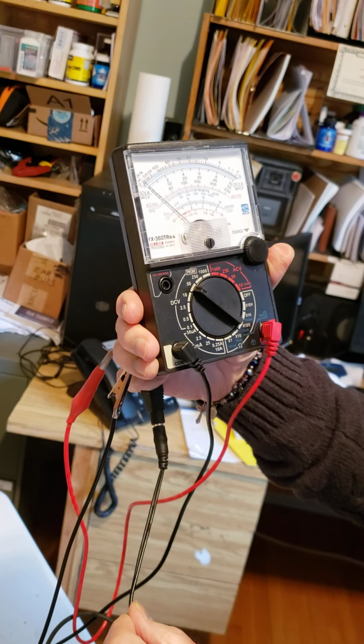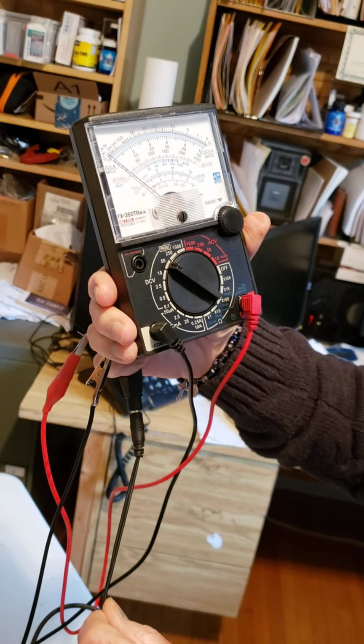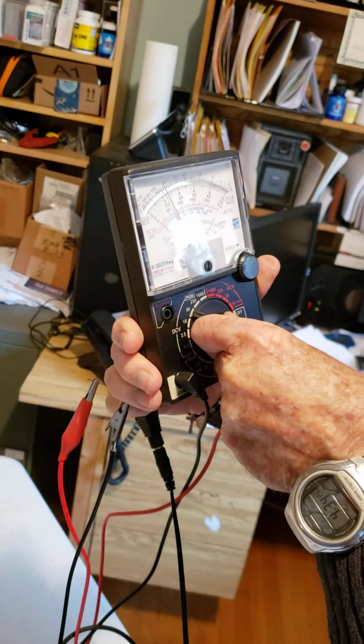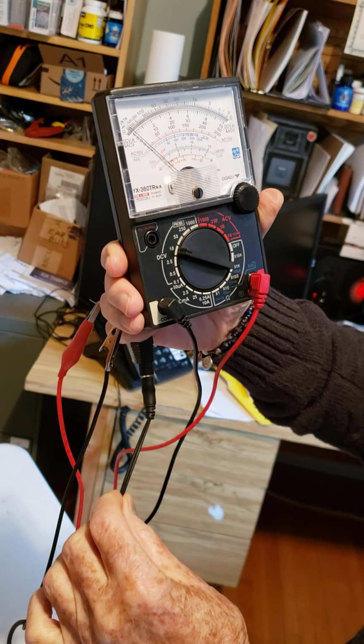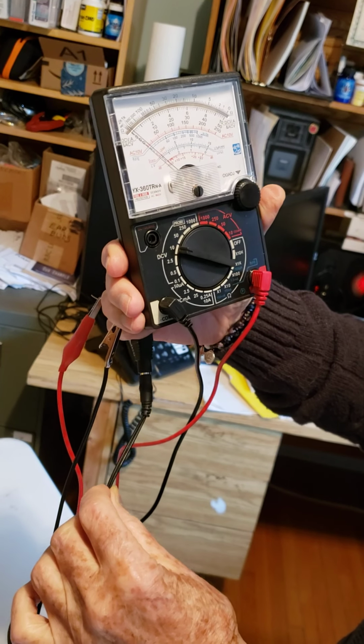Is there 12 volts coming, or isn't there? Now there is, now there isn't. See that? Maybe if I turn this up a little more sensitive. Yeah. So here again, see the break? Now there isn't, now there is, now there isn't, now there is.